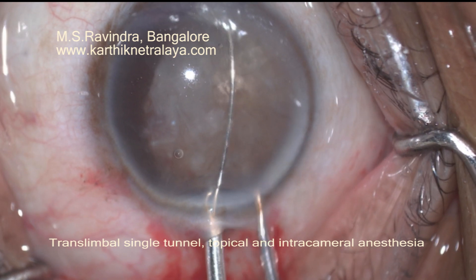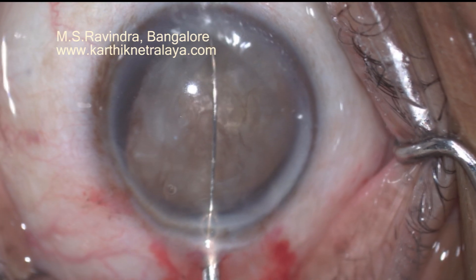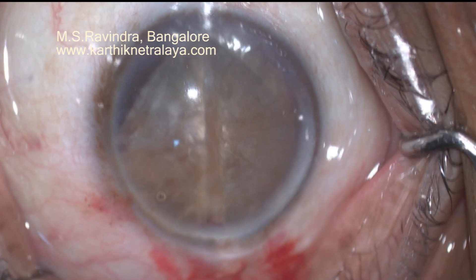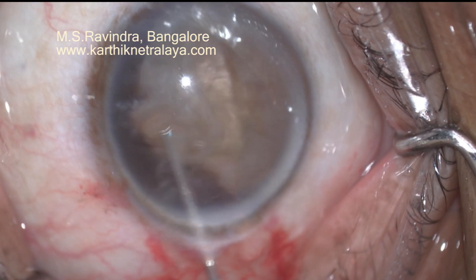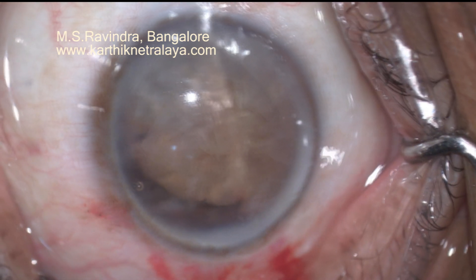A snare was introduced under visco protection behind the nucleus. The nucleus is well centered. The plane of the snare is exactly perpendicular to the plane of the nucleus.